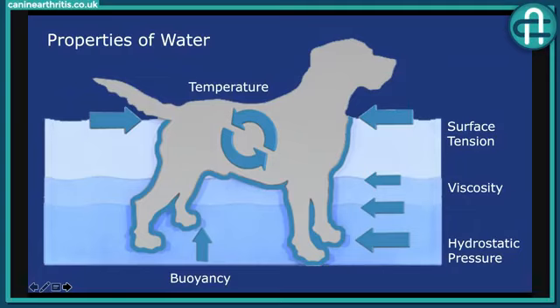And temperature. Most centres will operate the underwater treadmill at temperatures between 29 and 32 degrees. If it's a hot, sunny day, we might drop that a little bit, but certainly that's the recommendation, between 29 and 32 degrees. So there's a therapeutic warmth about it. For the osteoarthritis cases, you want the temperature on the slightly higher side to get greater benefit from it, so certainly towards the 32.